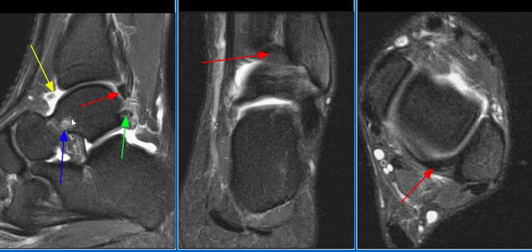There is osseous edema at the talar neck and roof of the sinus tarsi, consistent with a trabecular stress injury. The MR findings are compatible with posterior impingement due to a posterior labrum or thickened transverse ligament.